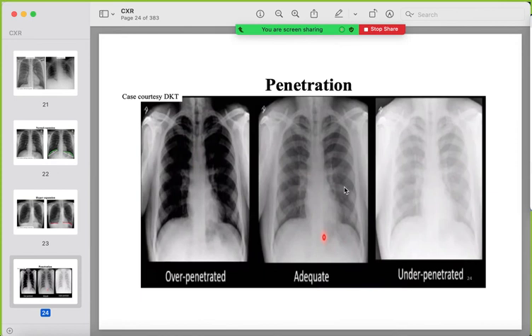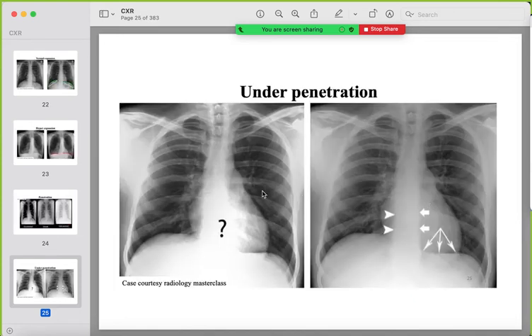The third thing to assess is penetration. On the ideal (adequate) penetration image you can see the ribs, underlying lung, and borders of the mediastinum clearly. With overpenetration the ribs are not clear; with underpenetration everything appears too white/soft. On good penetration you can see the medial parts of the diaphragm, paraspinal lines, cardiac shadow, and retrocardiac areas.